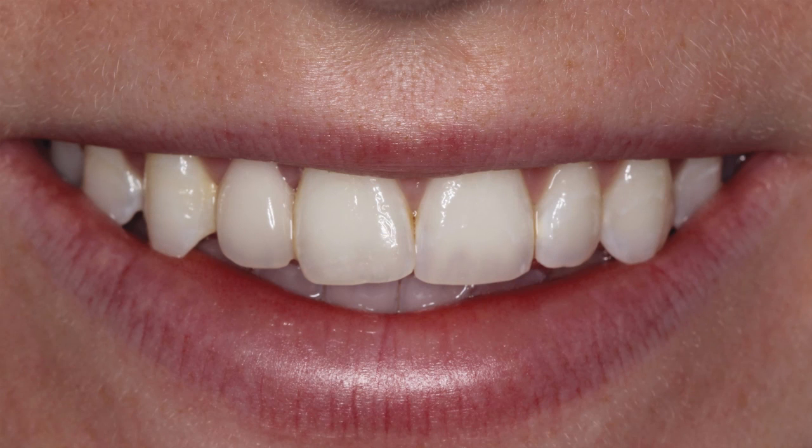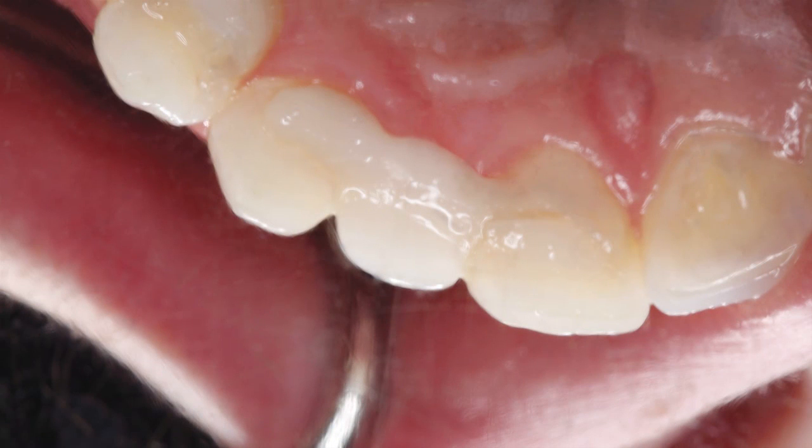The following case summary demonstrates implant placement in a 20-year-old female who presented with an acid-etched bridge that was used to restore her congenitally missing maxillary right lateral incisor. The patient presented with a cuspid and central incisor that were minimally prepared on the palatal aspect to support the wings of the acid-etched bridge.